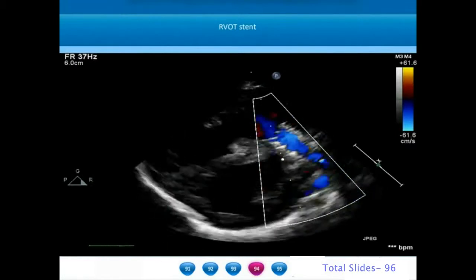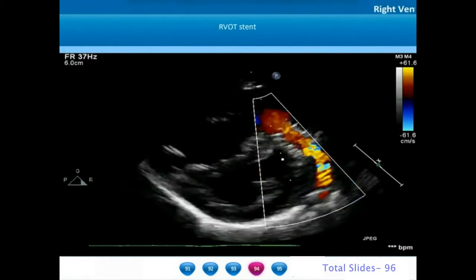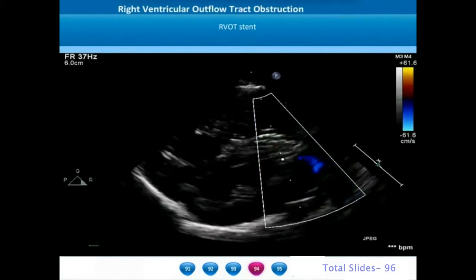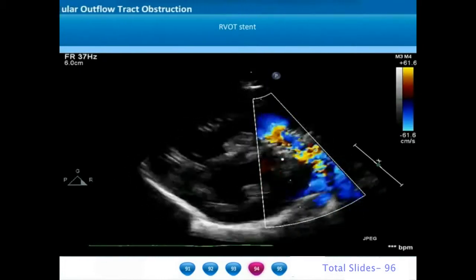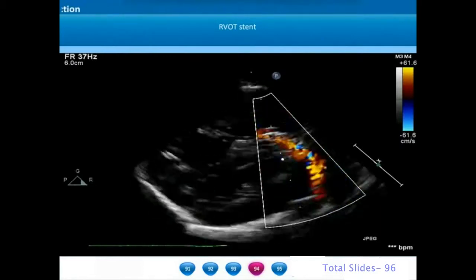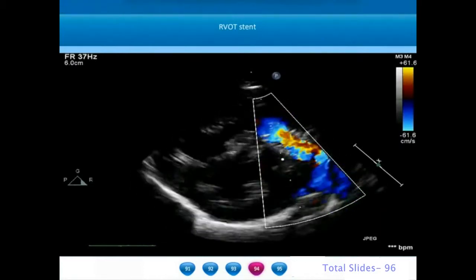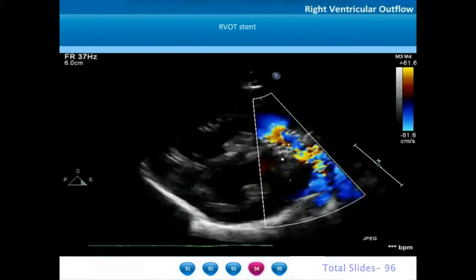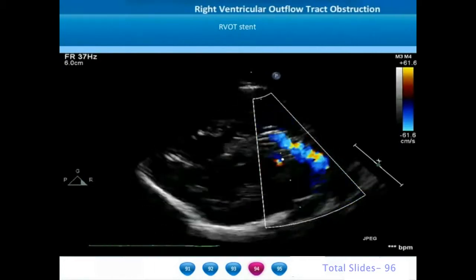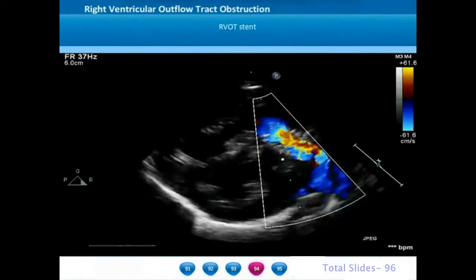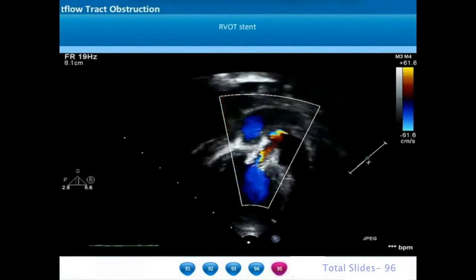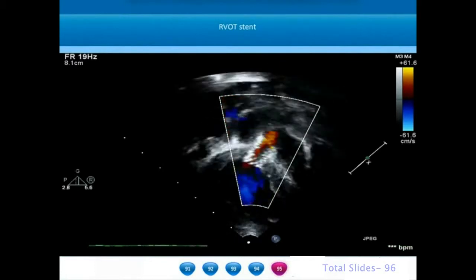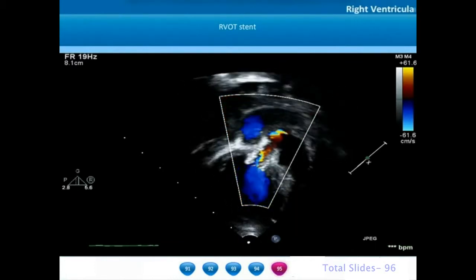In some patients with valvar pulmonary atresia, if pulmonary stenosis persists due to a narrow annulus, stenting of the right ventricular outflow tract is needed to open the region of the pulmonary annulus. In this example, the RVOT has been stented following a balloon pulmonary valvotomy and we can see the to-and-fro flows caused by free pulmonary regurgitation. On an apical anterior sweep, we can appreciate the right ventricular to pulmonary artery communication through the RVOT stent.